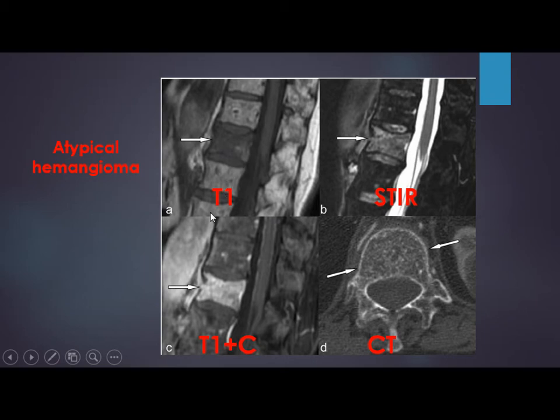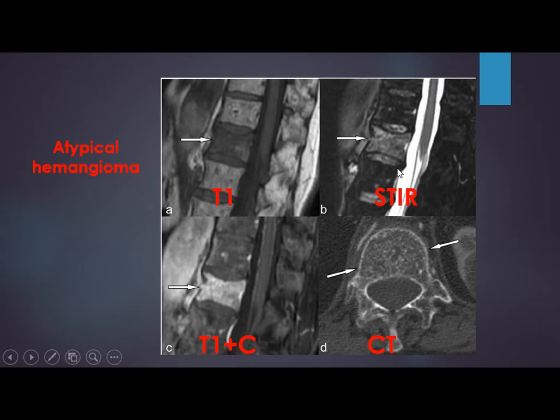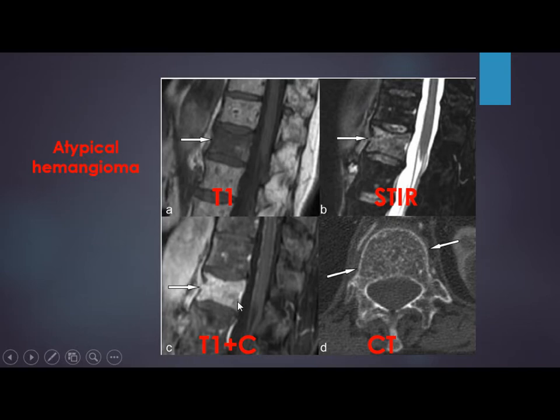In another case, T1 is low and T2 is high — this may be difficult to differentiate from lymphoma. On fat suppression, hemangioma is not markedly suppressed because it contains trabeculae and other tissue. This case is still highlighted on STIR. At that time, we cannot differentiate from lymphoma or metastasis. Hemangioma enhances markedly because of its high vascularity. But on CT, which gives the polka dot appearance, we can differentiate it. An article discussing the atypical pattern of hemangioma suggests that diffusion can help — hemangioma will likely not restrict on diffusion.